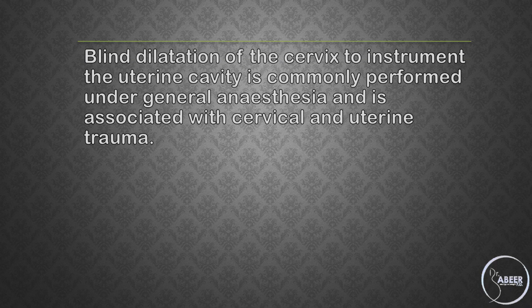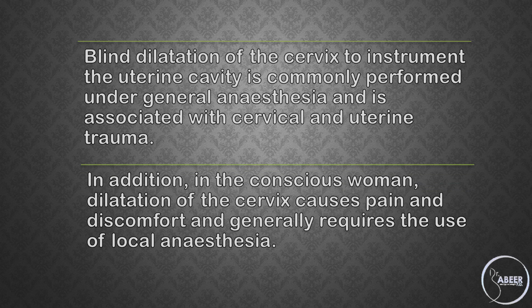Blind dilatation of the cervix to instrument the uterine cavity is commonly performed under general anesthesia and is associated with cervical and uterine trauma. In addition, in the conscious woman, dilatation of the cervix causes pain and discomfort and generally requires the use of local anesthesia.